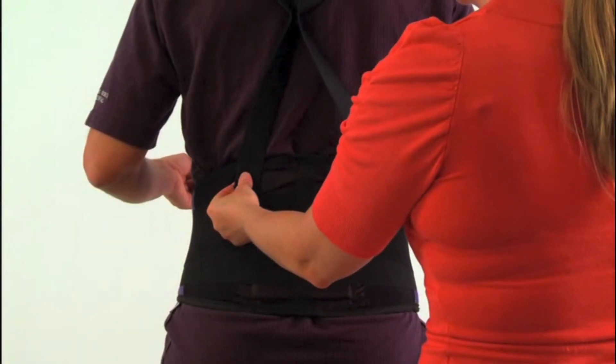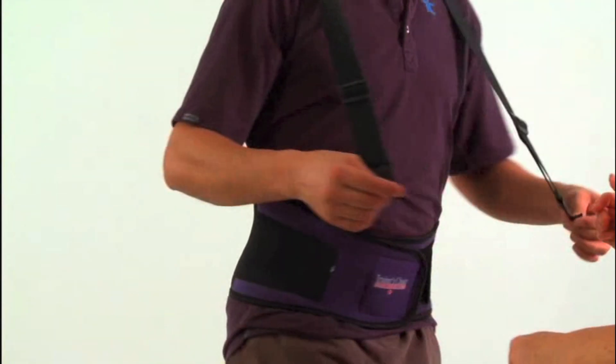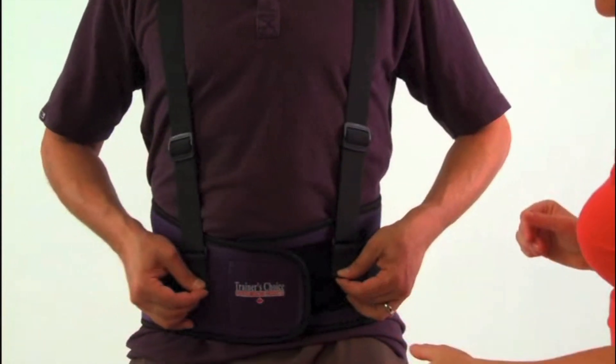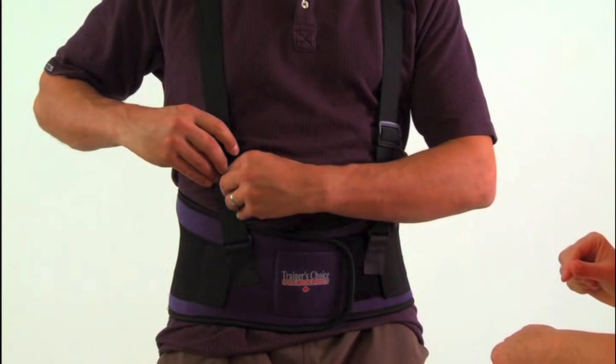To apply the optional suspenders, attach the Velcro tabs onto the opposing Velcro on the back of the support. Pass the straps over the shoulders and Velcro onto the base of the support at the front. The tension of the straps can be adjusted with the buckles on the front of the strap.